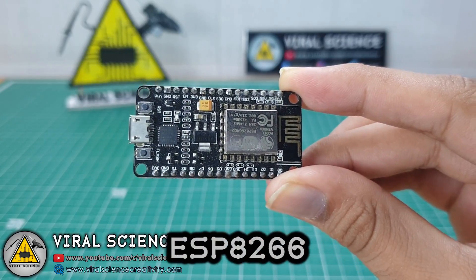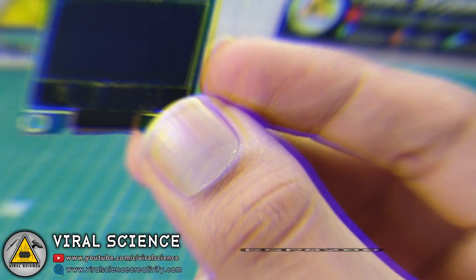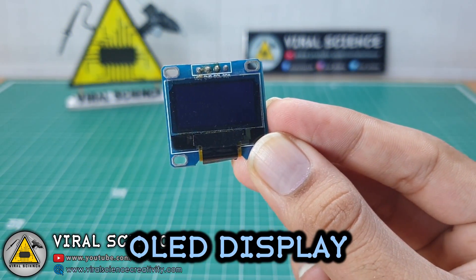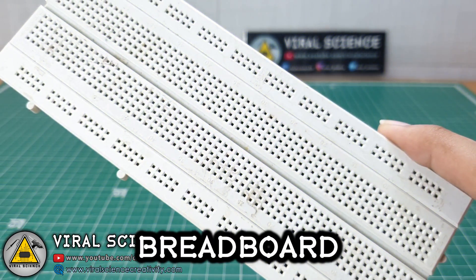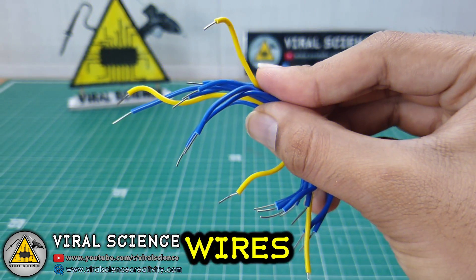For this project you will need an ESP8266 module, an OLED display, a pulse oximeter module, a breadboard, and some wires.